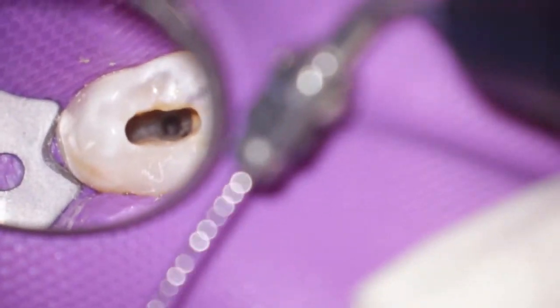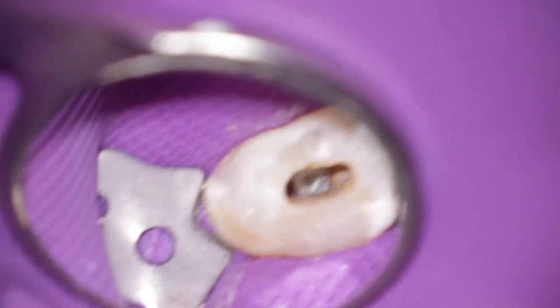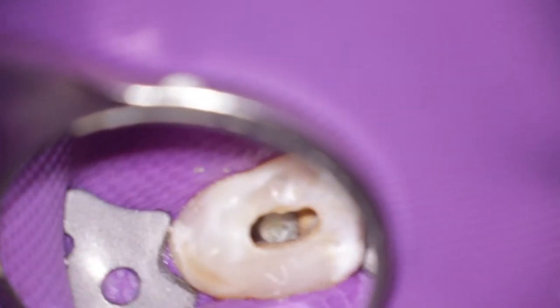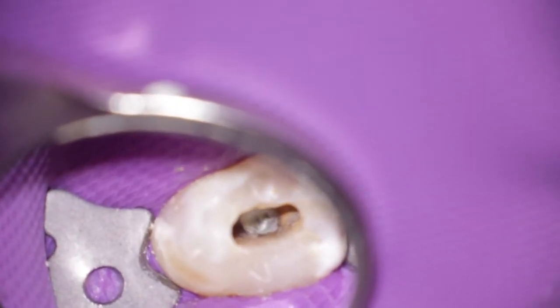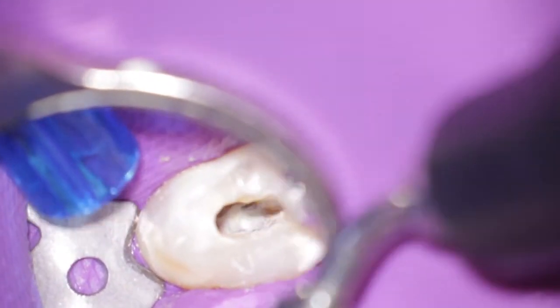Back to ultrasonics. So how can you uncover the canal entrances without sacrificing too much sound dentine and time? Of course, with the help of ultrasound. As you can see in this example, two entrances, the buccal and the palatal canal, are already discovered. So is this a reason to shout hooray already? A second canal in an upper premolar? No, certainly not, because we have seen the X-ray and there is more work to do.